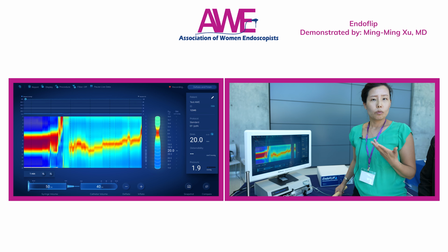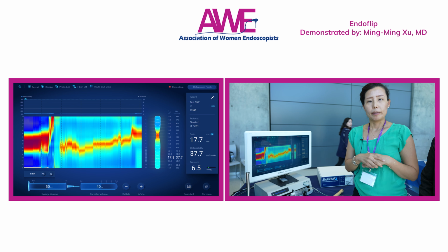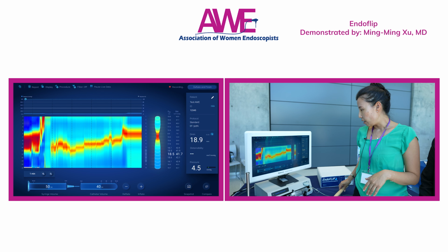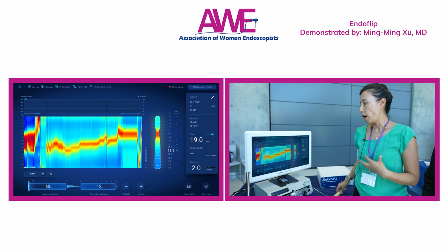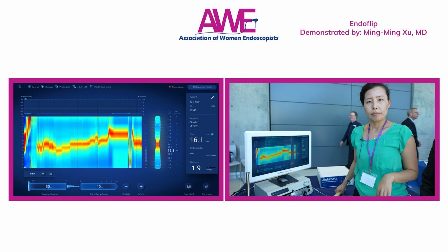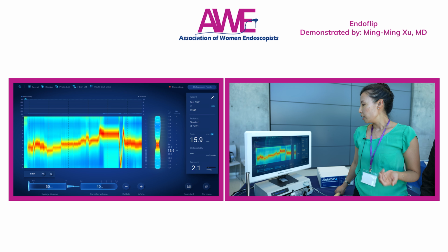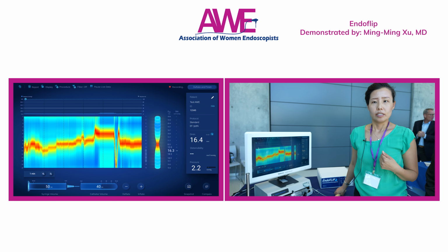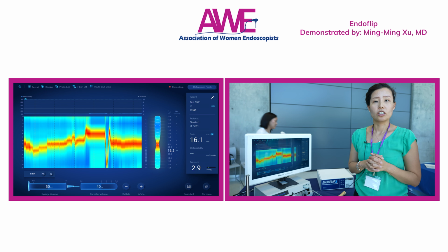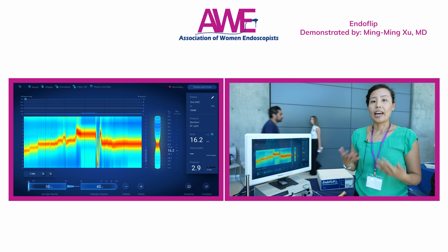And clinically, this is a topography map, which shows you the peristaltic waves as they go through the balloon, mimicking the peristaltic waves of the esophageal body as waves of peristalsis go down. I don't necessarily use the topography map that much, but that's present as an extra feature. But clinically, what I use it for, especially in POEM, is an intraoperative, almost real-time manometric measurement of the LES pre-POEM and post-POEM to check the adequacy of the myotomy.